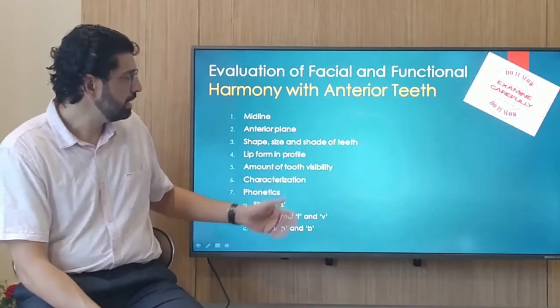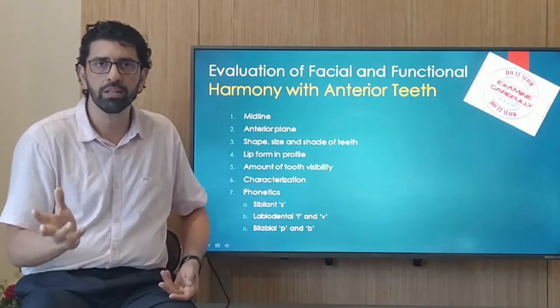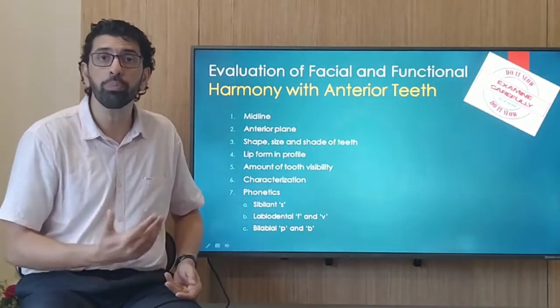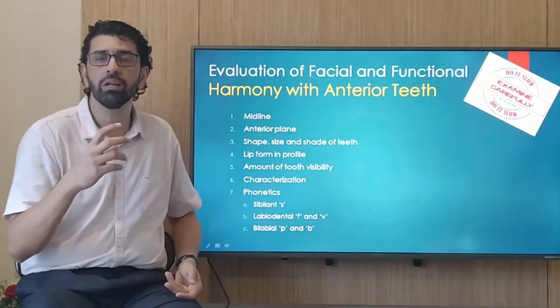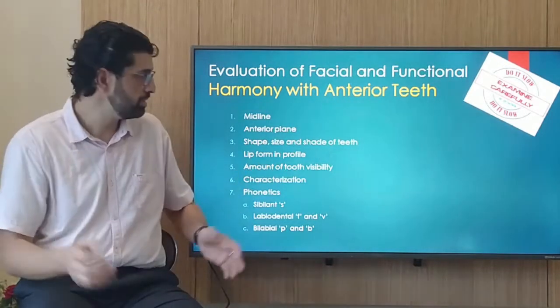Then characterization. Some patients may have trademark characterizations that they would like to retain. If they are reasonable and practical, you can incorporate those individual characterizations into the denture gladly, so that the patient will come out looking much more natural than with an ideal sort of setup.